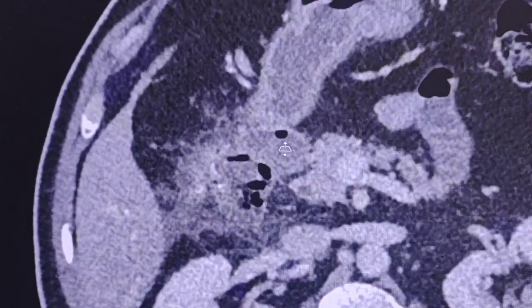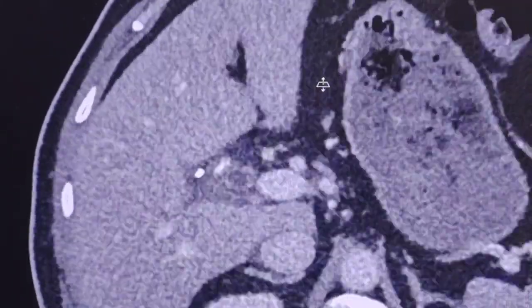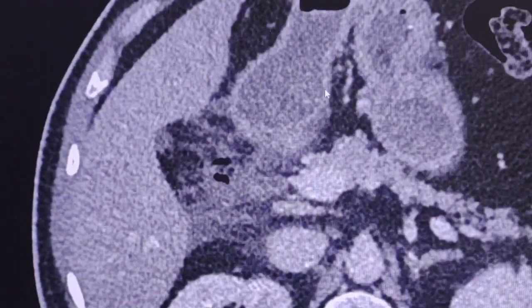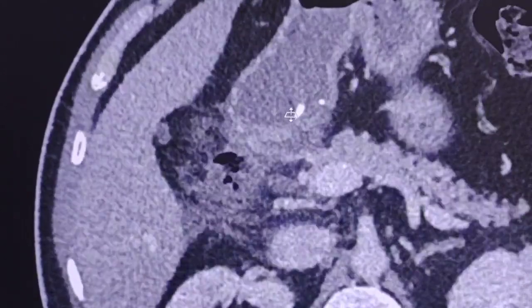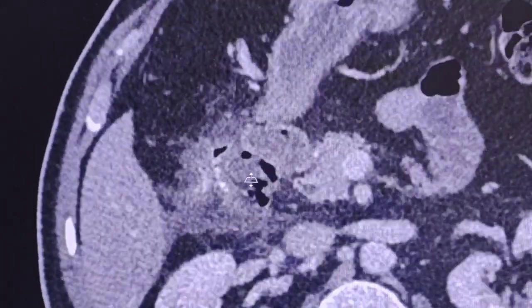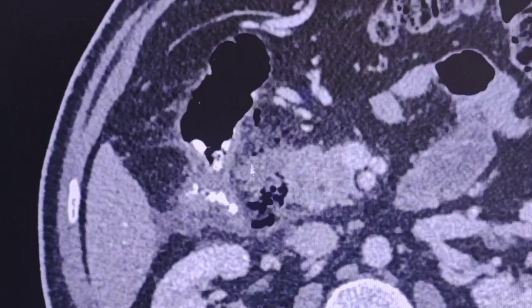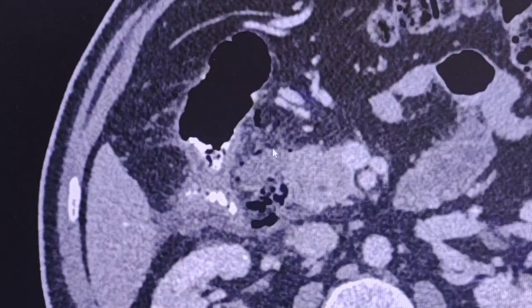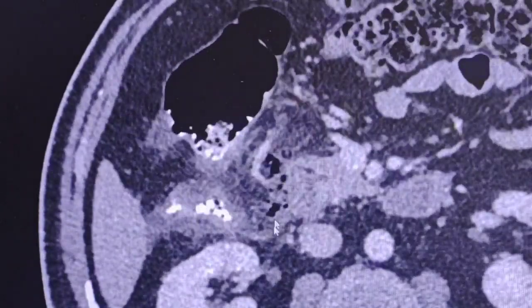I will scroll the images up and down to review the findings again. Here is the stomach. Let's concentrate around the duodenum where the perforation was found. Gas bubbles here — free air in the abdomen, extraluminal gas.